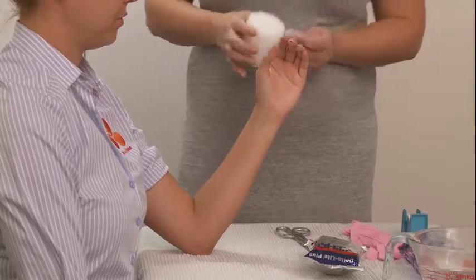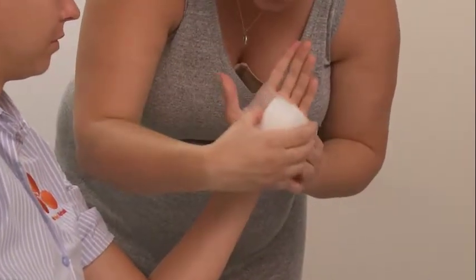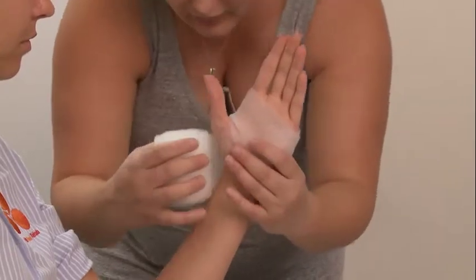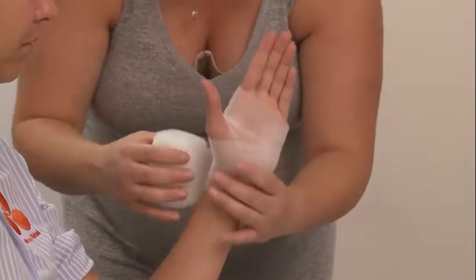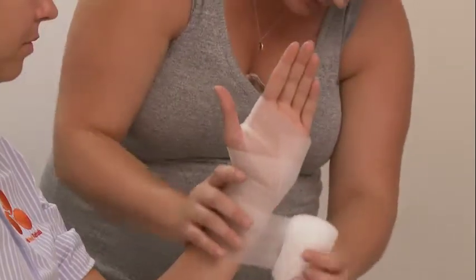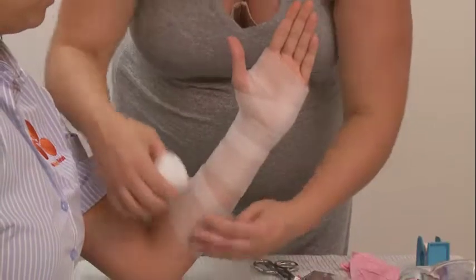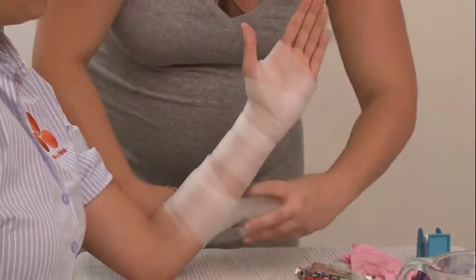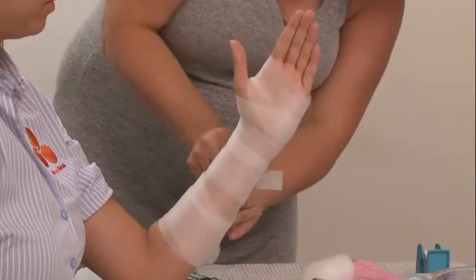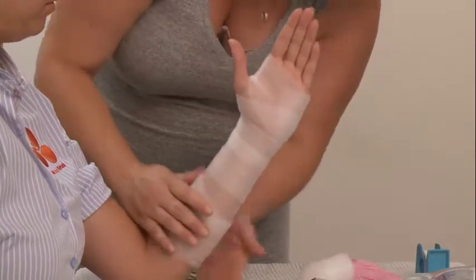We're going to start by applying the waterproof padding. This padding doesn't need a lot of overlap, so I'm only going to go for one to two layers — anything more than that adds too much bulk. You'll notice I'm going with about half overlap. You start by applying the scaphoid cast just as you would for a wrist cast, and we'll add the thumb component once I've finished the wrist component. At the proximal forearm it's quite long, and distally I've gone quite high above the MCPs. You want the underpadding to finish about one to two centimeters more distal or proximal than you want the cast. It looks quite high like it might impact MCP flexion, but the waterproof padding won't restrict movement at all.